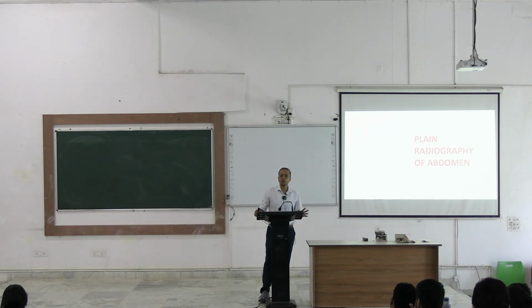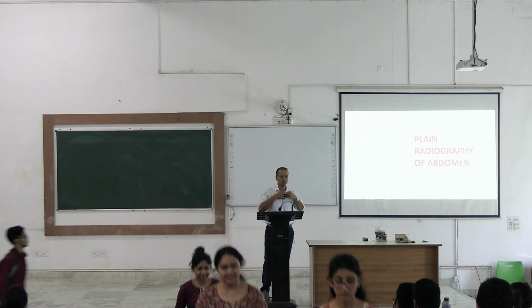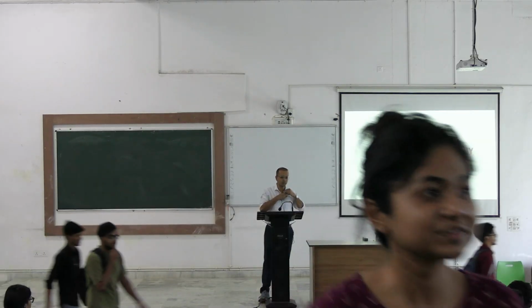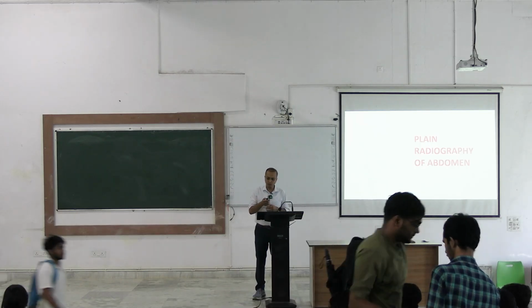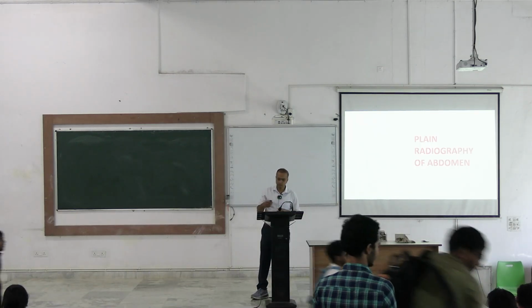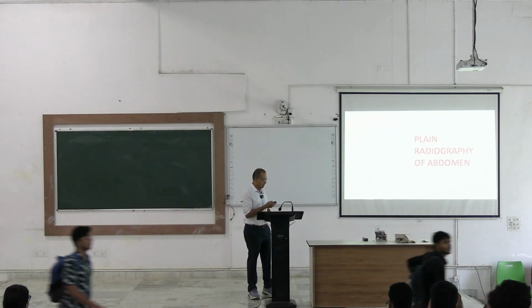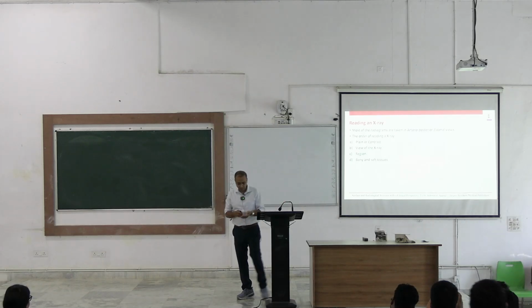So these two domains we will be discussing here in abdomen. We begin with the plain X-ray, then we move to the special X-ray of the abdomen, and we'll conclude after that. It's going to take like 20-30 minutes to explore these things. So beginning with the plain X-ray.